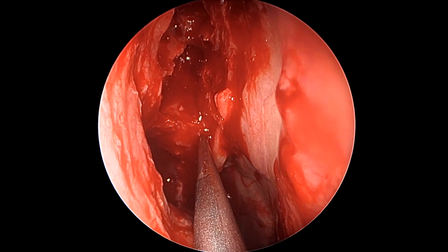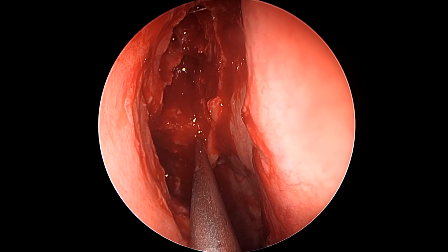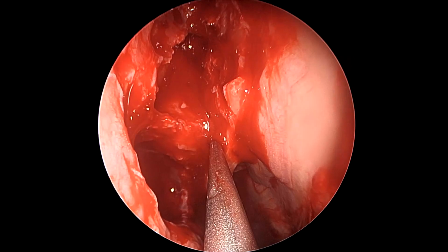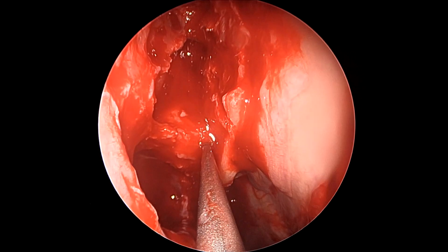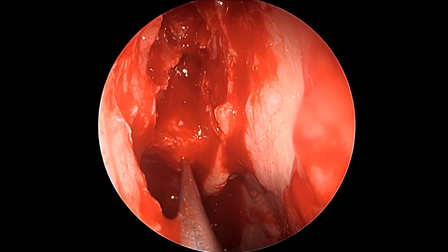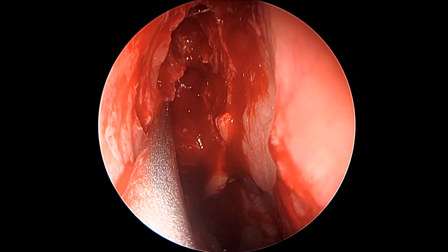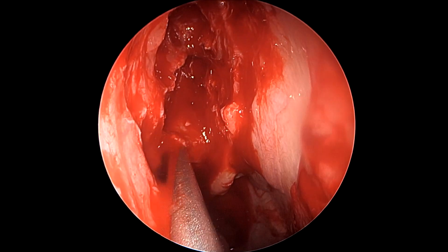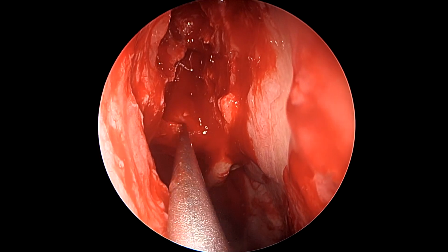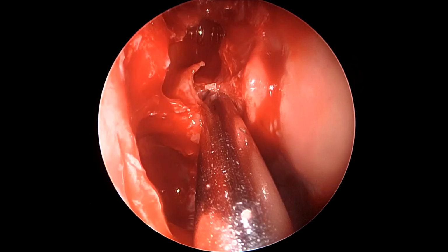Now this navigator probe points to the horizontal antrostomy ridge, which is the medial orbital floor, the superior wall of the maxillary sinus. And that is a very, very reliable and consistent landmark towards entry into the sphenoid sinus or the sphenoid os. The sphenoid os, if not found or scarred, can always be found at the same level as the medial orbital floor, or the so-called horizontal antrostomy ridge.